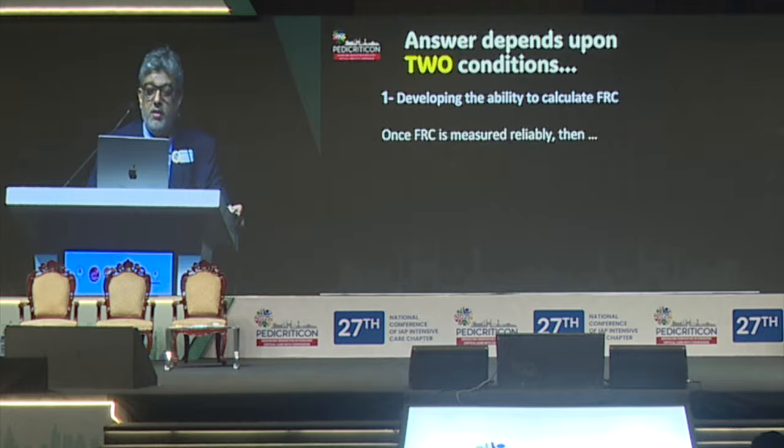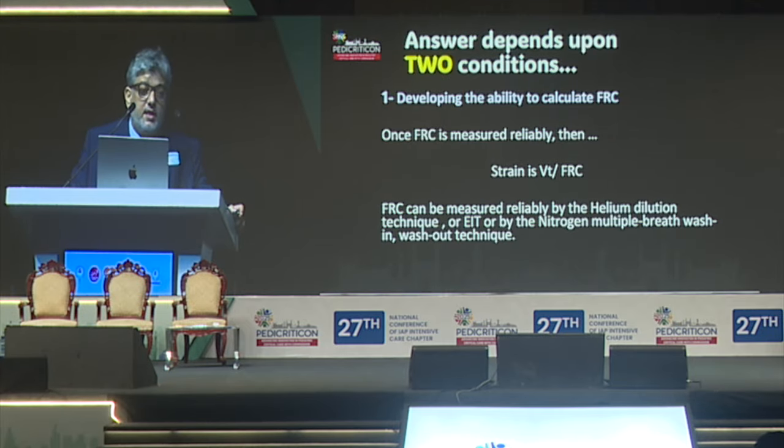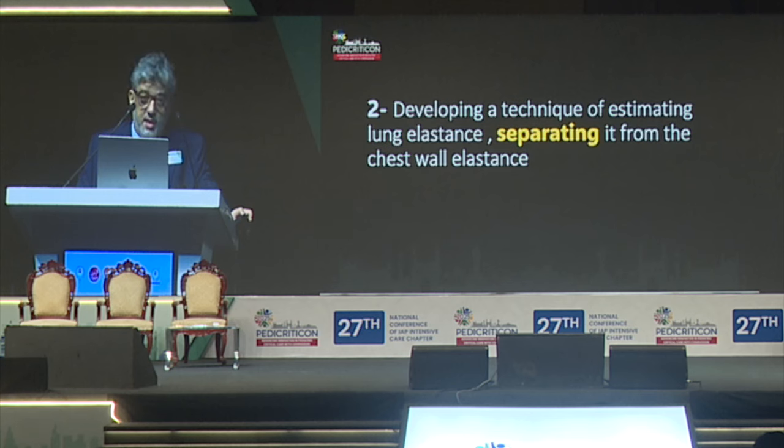And once you have FRC with you, then you can take the ratio of VT divided by FRC and calculate strain, simple. And FRC can be measured by various methods like electrical impedance tomography. It can be measured by the nitrogen multiple breath wash-in wash-out technique in GE ventilators, or it can be measured by the helium dilution technique.